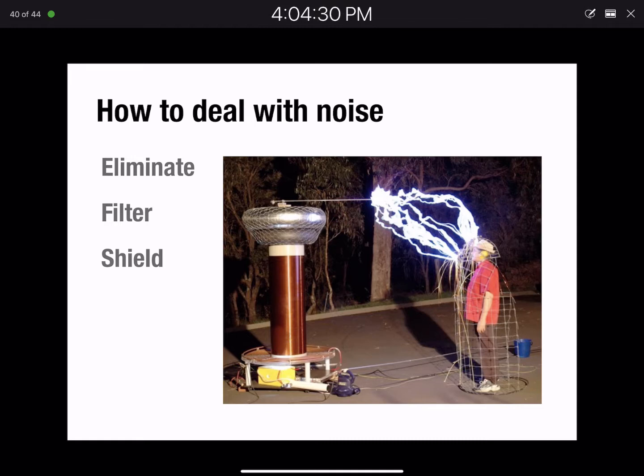Mostly you're dealing with artifacts coming from the stuff that has to be in the room anyway, like the computer screen and other electronic devices that might be present, and that's pretty much it. The other thing is any wire that's coming into that room. With a Faraday cage, there are ways of having fancy connectors that filter out things coming in.